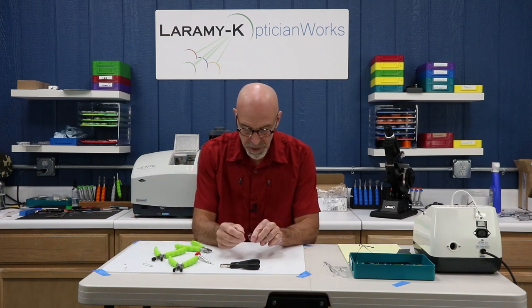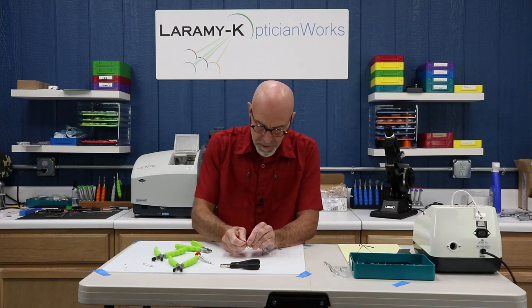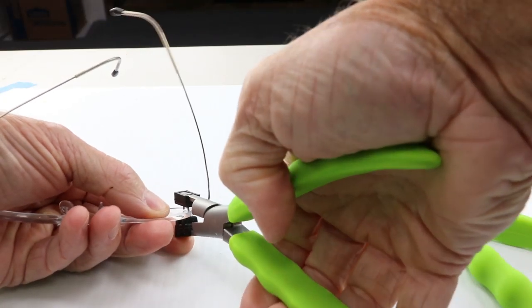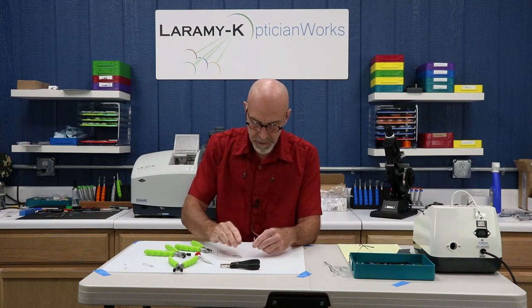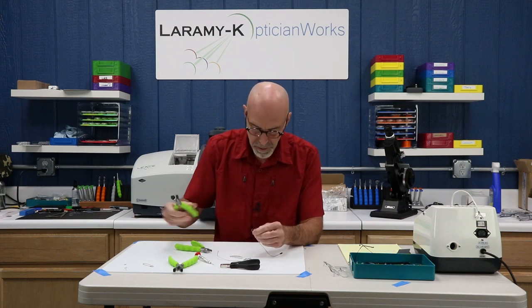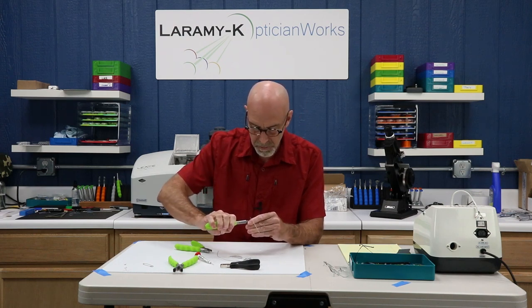Now I need to separate this — I need to get this temple off, get the bridge, and get the other temple off as well. I can do that by hand, but it doesn't want to come apart easily, so this is where the tool comes in handy. The bridge is usually quite easy since you've got some good leverage. Always use your tools from the top on these — you're far less likely to pinch a lens and damage it.